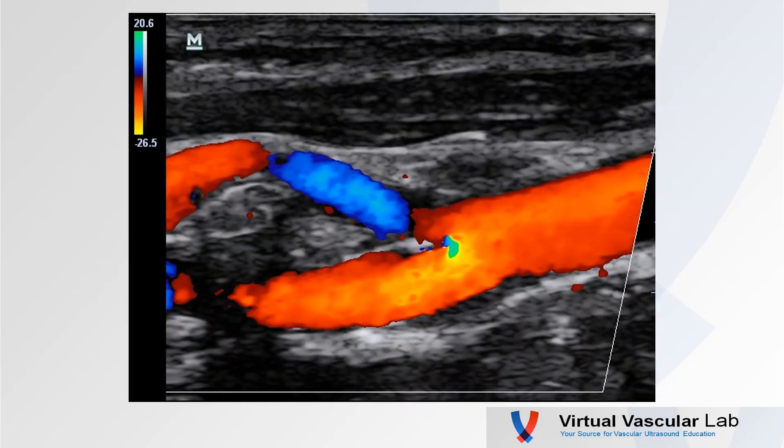A quick look at a carotid bifurcation — we see the distal common carotid and internal carotid artery, with flow away from the transducer shown as red. We also see that short segment of the proximal external carotid artery. In this case, the instrument sees flow moving towards the transducer, so it's colored blue.